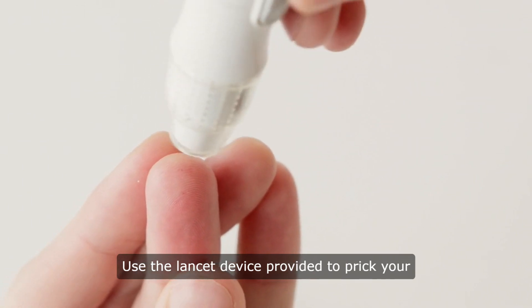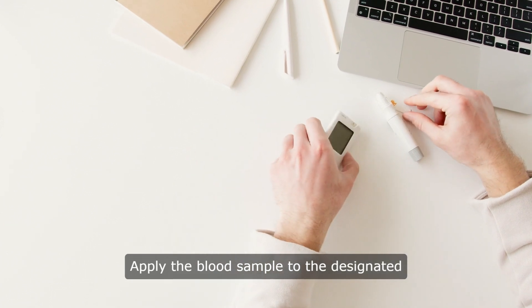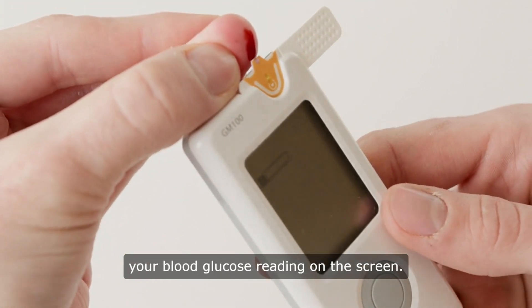Use the lancet device provided to prick your fingertip and collect a small drop of blood. Apply the blood sample to the designated area of the test strip on the meter. Within seconds, the meter will display your blood glucose reading on the screen.